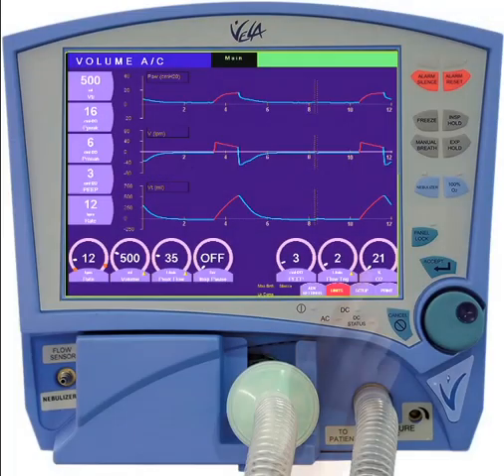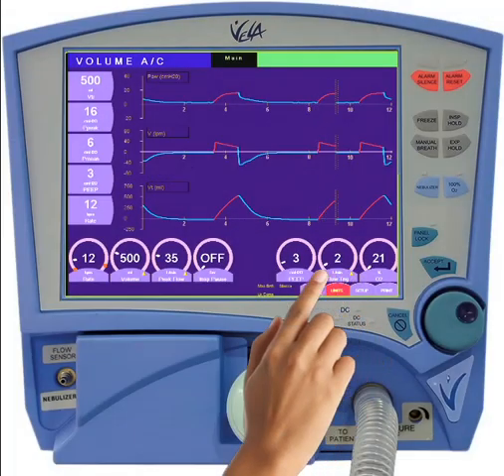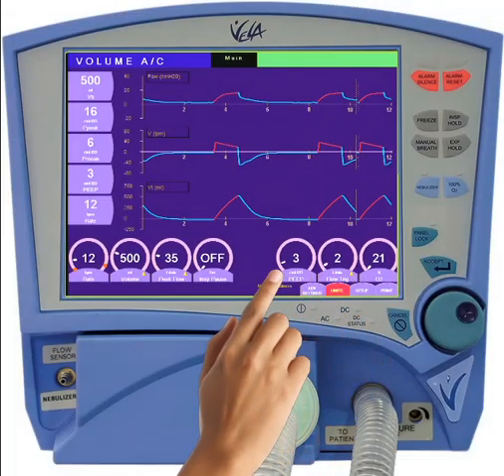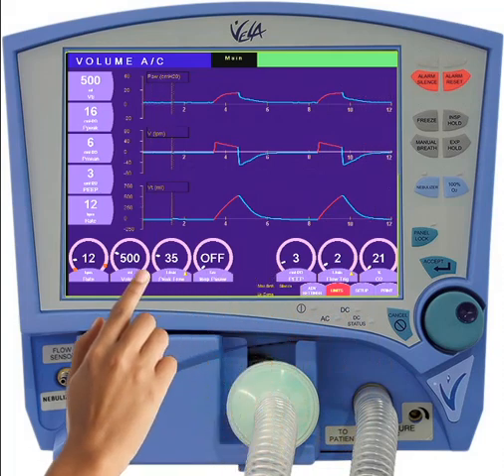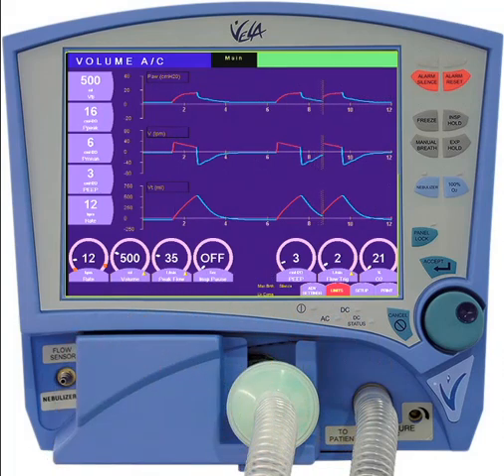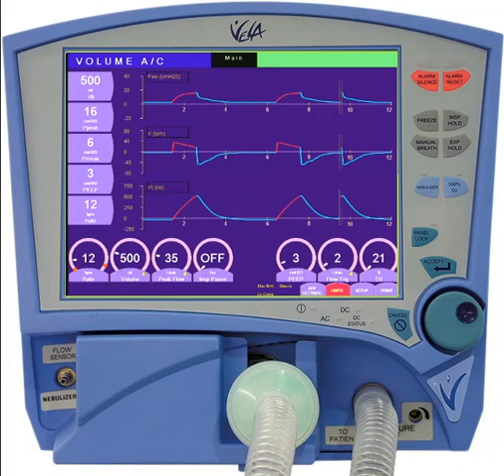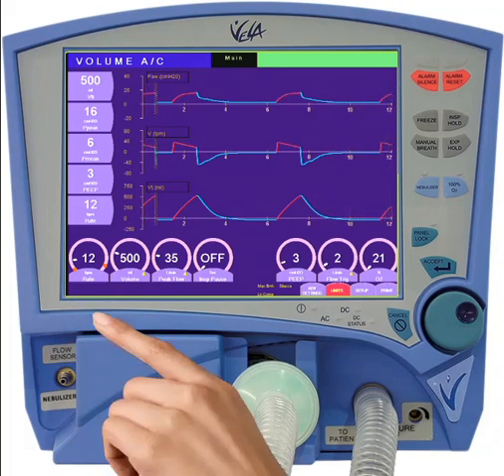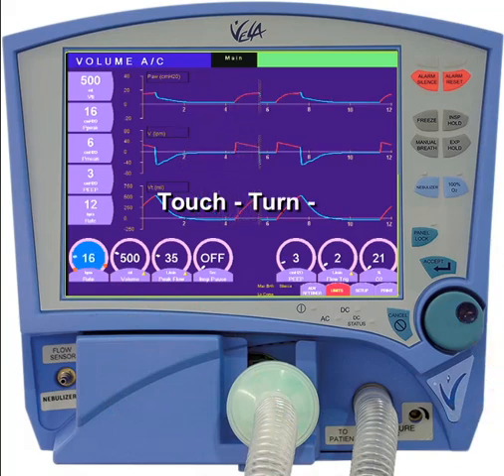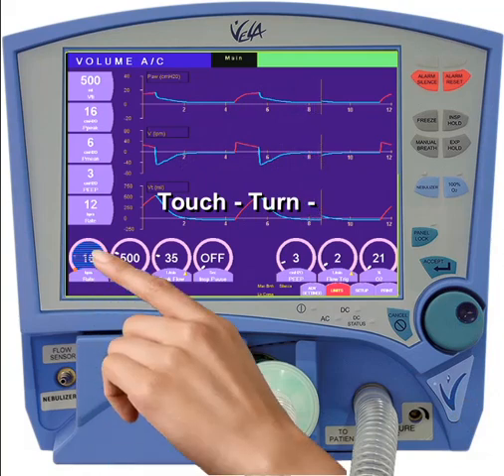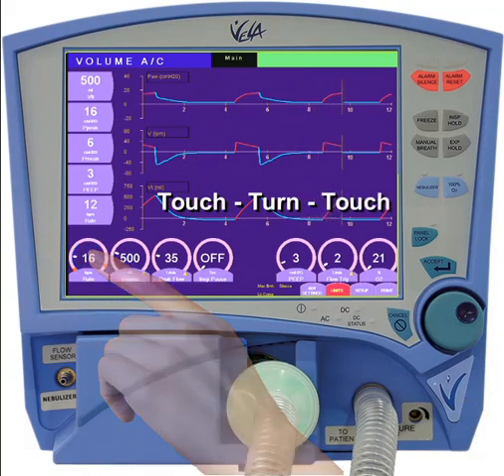The primary controls on the Vela Ventilator can be found along the lower edge of the screen. To change a control setting, simply select the control that you wish to change, turn the encoder to the desired value, and either touch the control again to accept it or use the Accept key on the front panel.